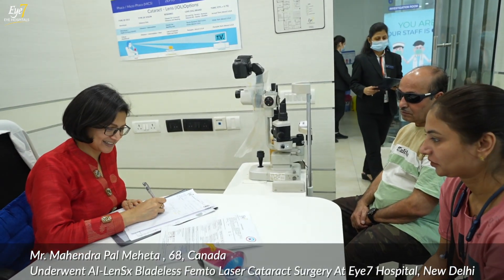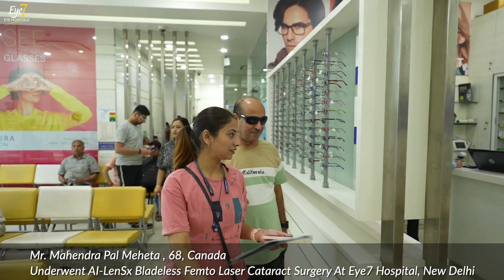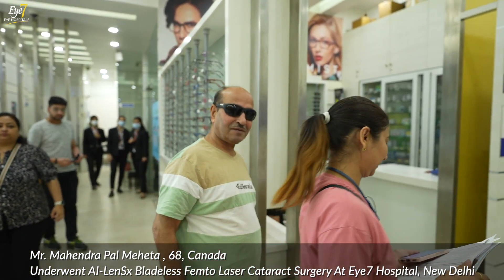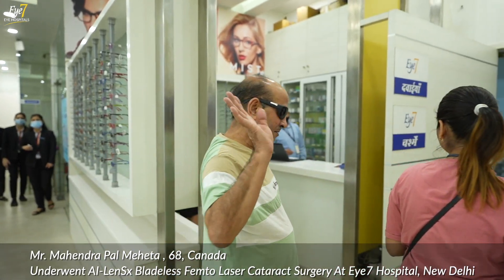Yesterday, when I went to the operation, I was given a lot of attention. When I went to the operation, I was given a lot of attention. I am very happy.